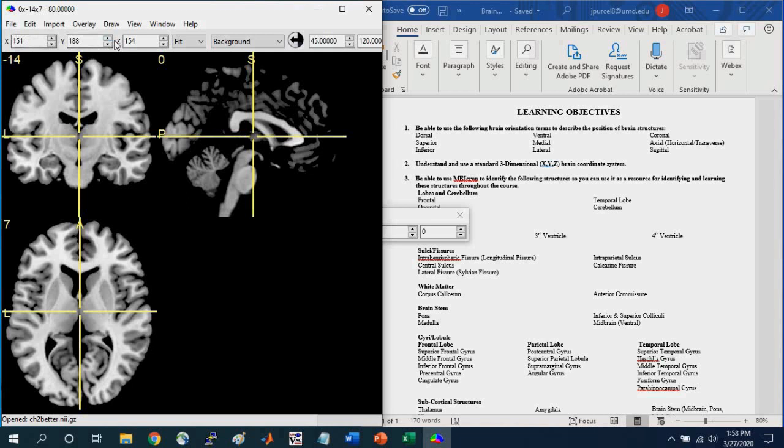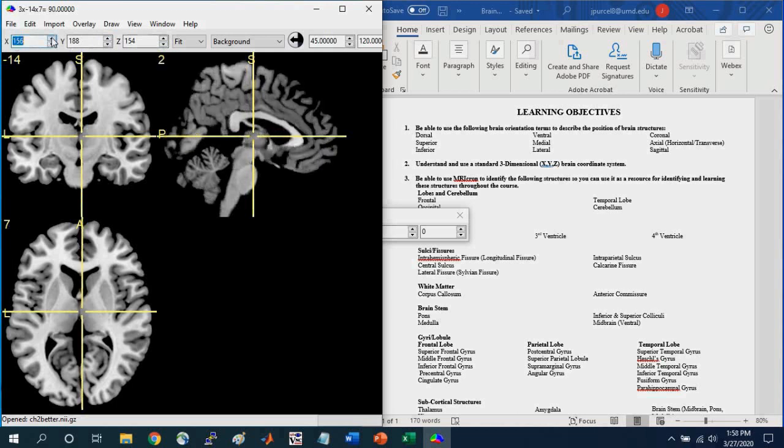These numbers don't match what you see for the X, Y, Z coordinates in the MNI system. But I can navigate using these toggles here.